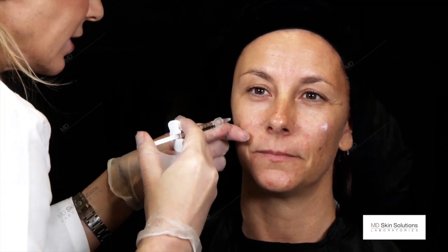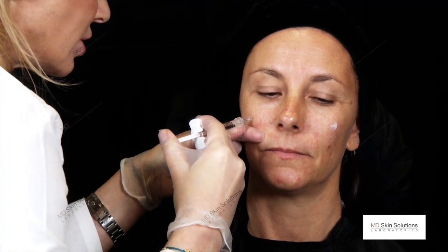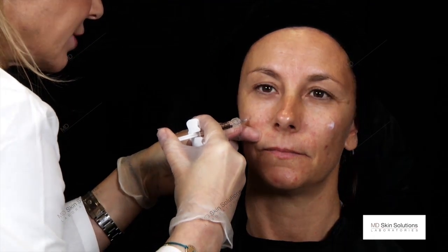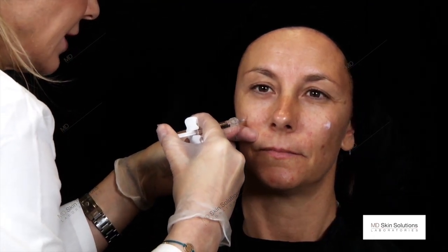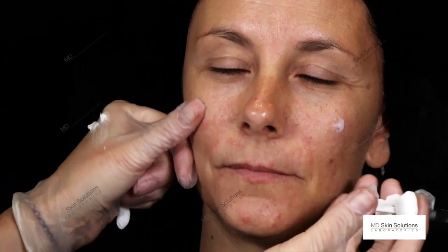Second, we do place on the cheek apex point, gunshot-wise, a 0.2 in a tunneling way. On withdrawing the needle, we place 0.2 ml on one point, and a second point in a banana-wise fashion.